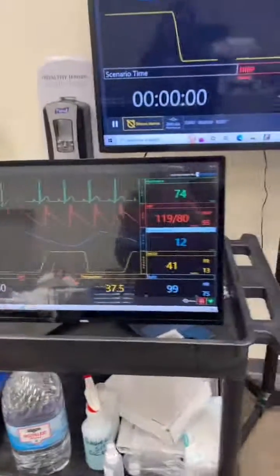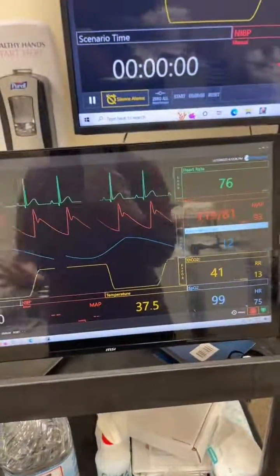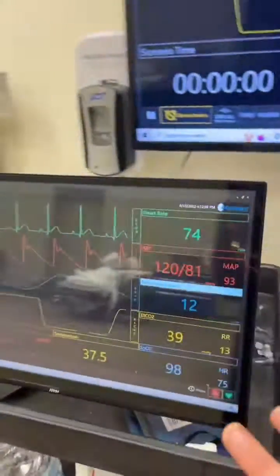Here's an example of a patient monitor. This is a sim lab — this is not an actual person. So let's walk through what all these numbers are.